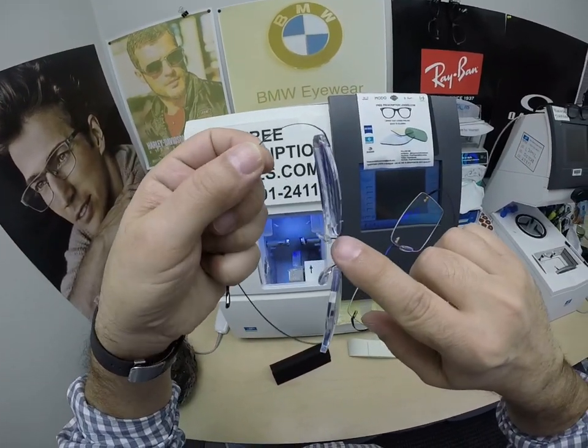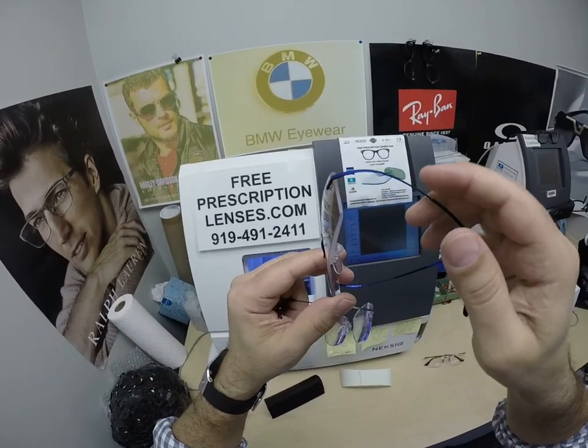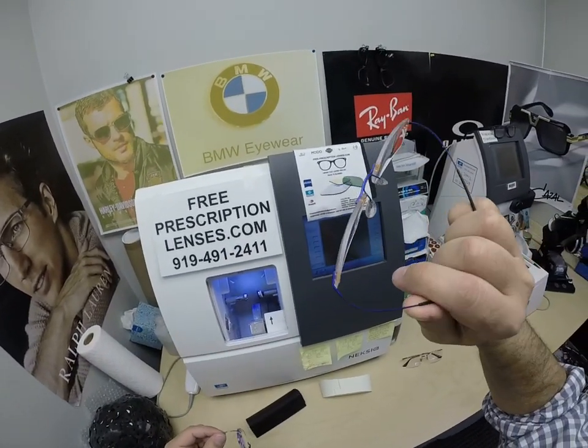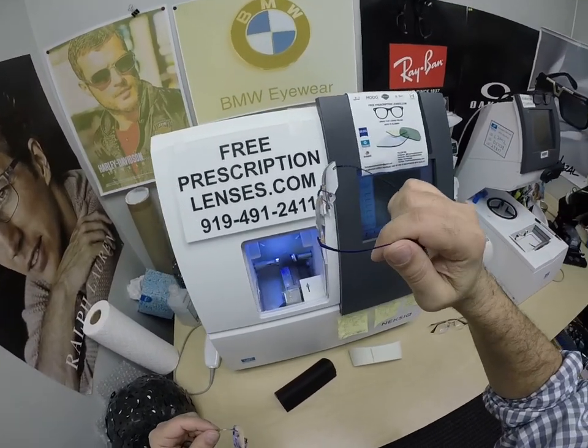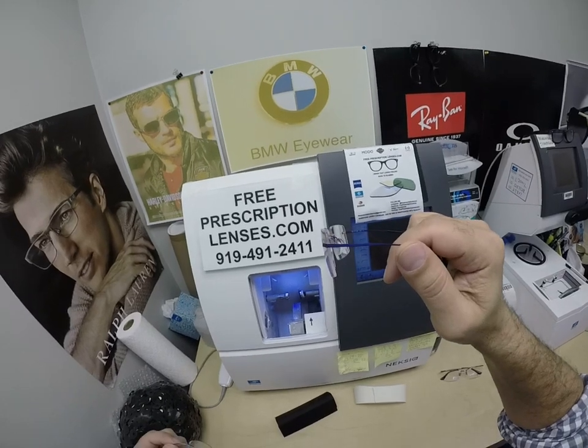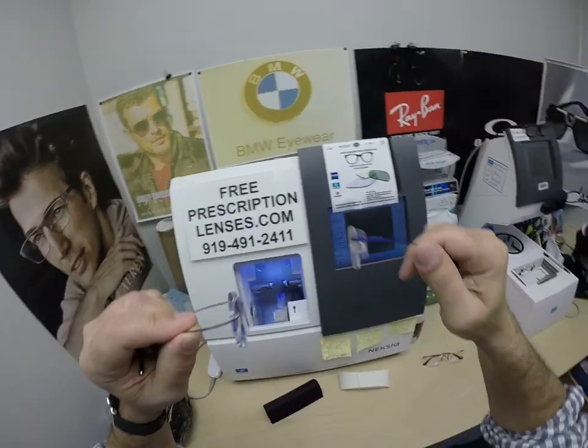You can see how shiny that is all the way around both lenses. I have a non-polished lens in mine — let's try this again. Non-polished lenses. Polished, non-polished.